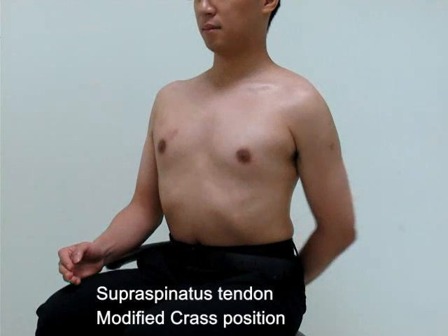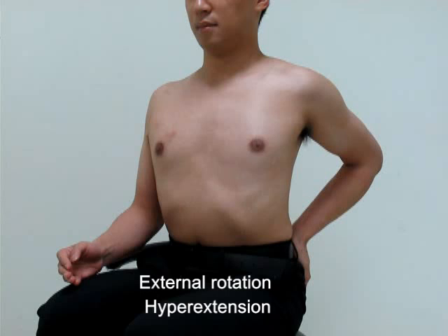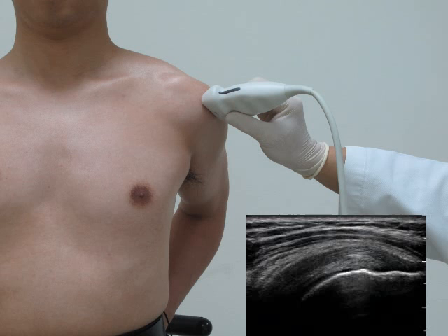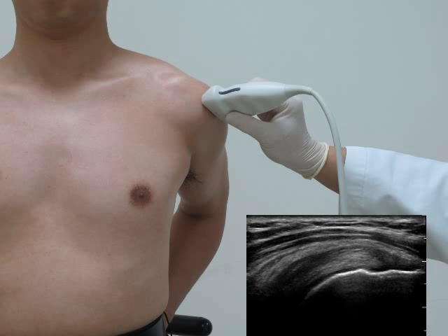An alternative position to image the supraspinatus tendon is called the modified Crass position. Have the patient put the palm on the back pocket while keeping the elbow directed posteriorly. The shoulder is now in external rotation and hyperextension. The transducer is placed parallel to the humeral shaft so that the long axis view of the supraspinatus tendon can be taken. This position is especially useful for patients who cannot tolerate shoulder pain at internal rotation.